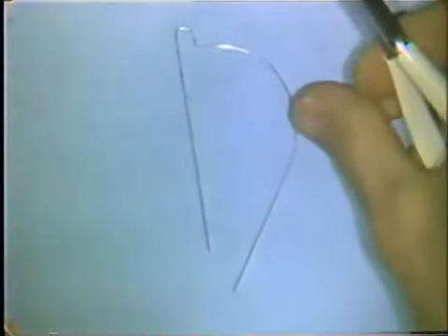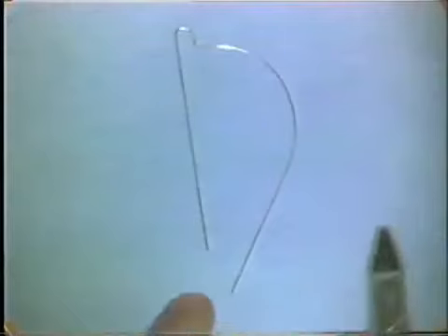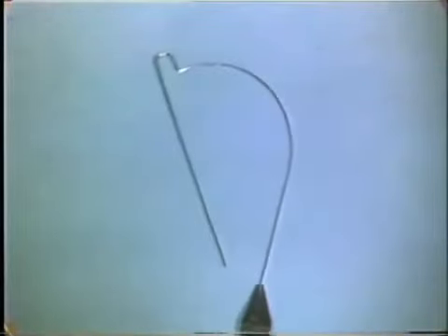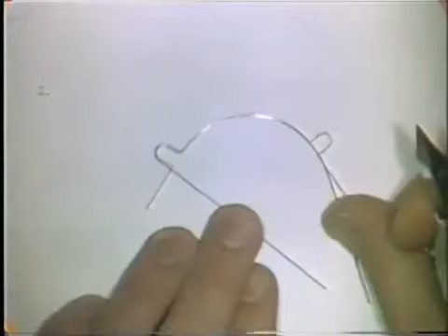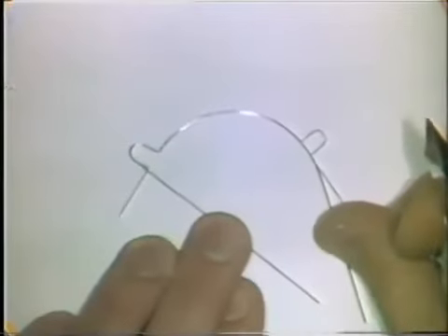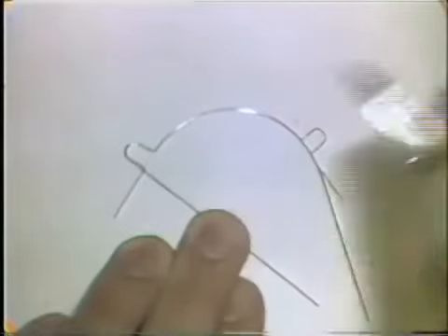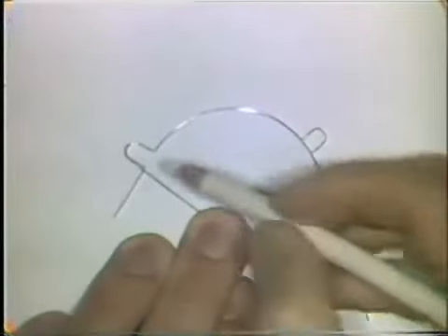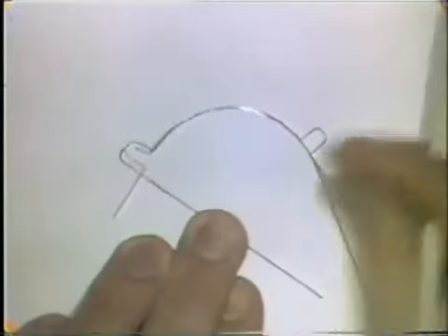The loop and the curvature now are pretty much in the same plane of space. It's possible now to mark the wire and continue the last leg of that loop in the final 90-degree bend. A little more curvature is needed in the loop here, and the next 90-degree bend is going to be started right there where I'm marking the wire.